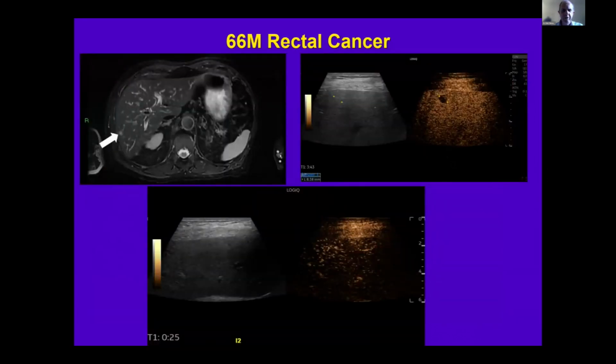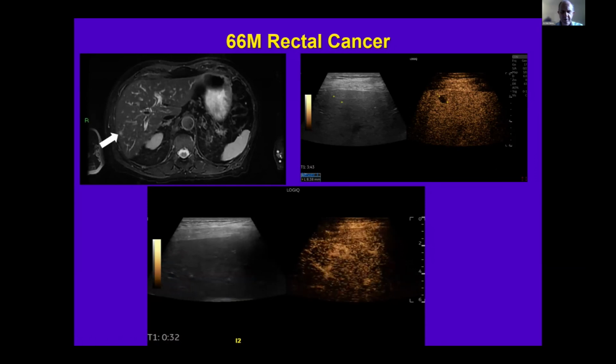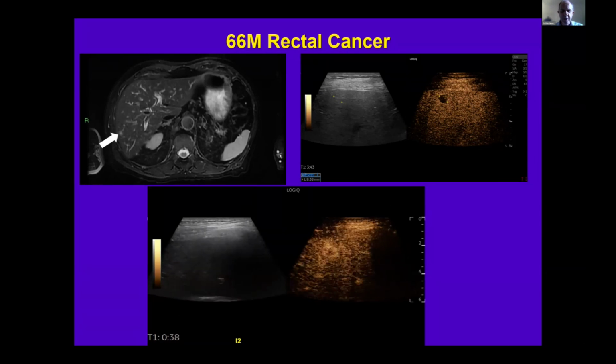And here's a little lesion I was talking about earlier. We get referrals from MR and CT. So, a tiny little lesion in the liver. So I scanned through, and in the late phase at 3 minutes 40, I found this little lesion here, 8 millimeters. And then I went back and injected another dose of contrast agent, because now I know where it is, so I can go straight to the lesion. This shows rim enhancement of the lesion, and then we know that it's washed out in the late phase. So despite it being 8 millimeters, we can say categorically that this is a metastasis. But on MR, it could have been hemangioma or anything really. So it just shows you the resolution that we've got using this technique.